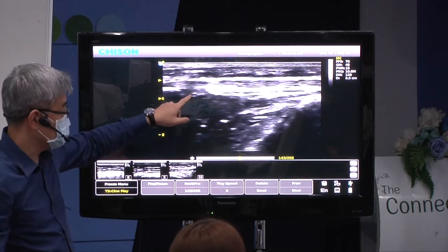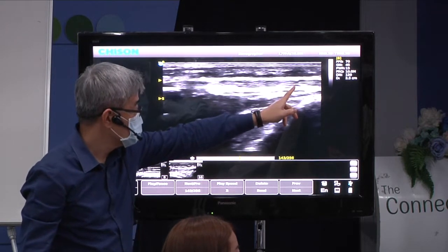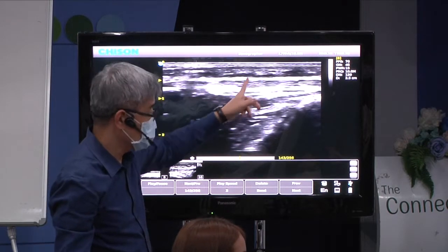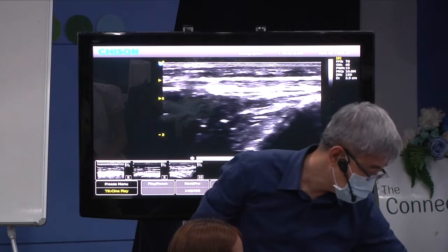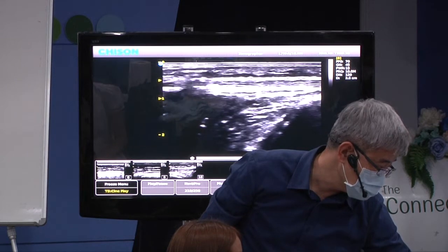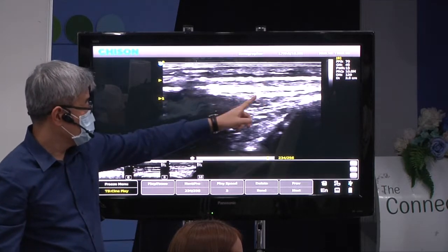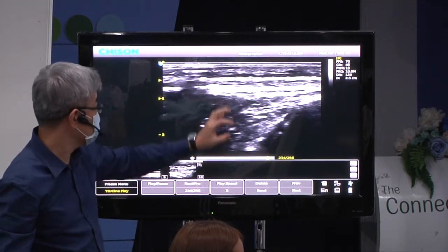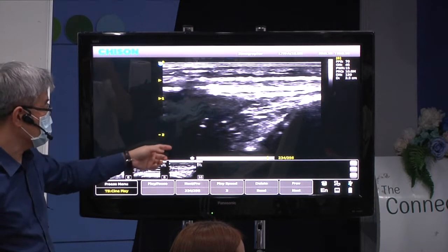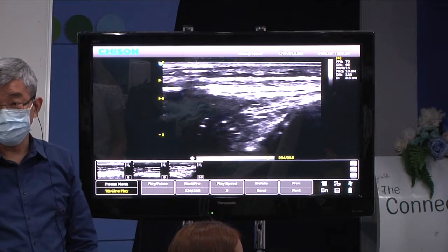If you would like to discuss the patellar tendon with someone else: superior border, inferior border, okay, and no two-layer structure. I will say the image quality is still not good enough, but superficial border, inferior border, two-layer structures, right. Focus, depth, I probably cannot change with this device. Then I will say, okay, this image quality is much better. Okay?